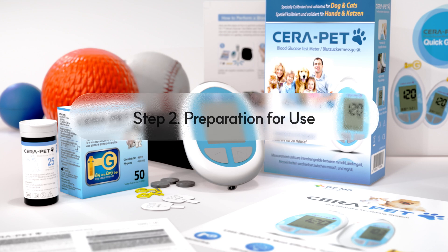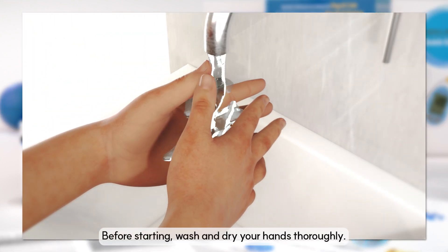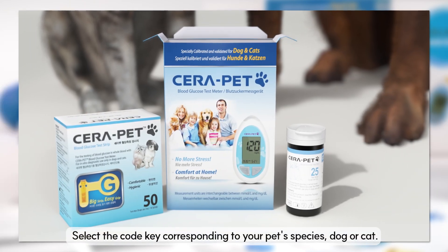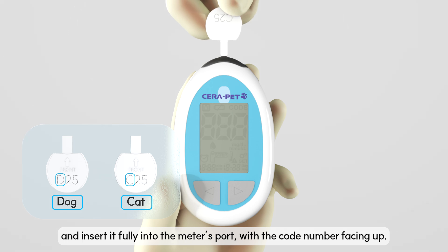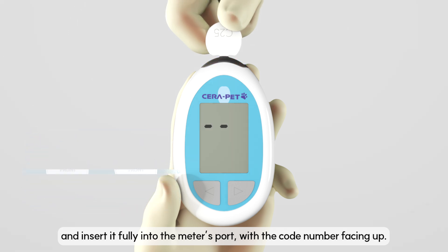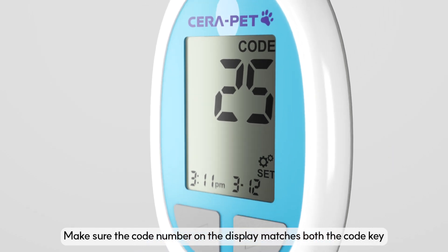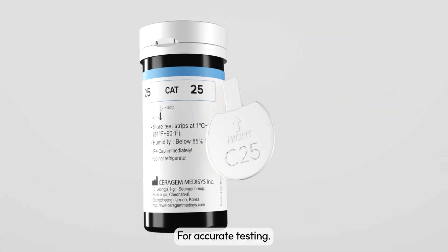Step 2: Preparation for use. Before starting, wash and dry your hands thoroughly. Select the code key corresponding to your pet's species — dog or cat — and insert it fully into the meter's port with the code number facing up. Make sure the code number on the display matches both the code key and the test strip for accurate testing.